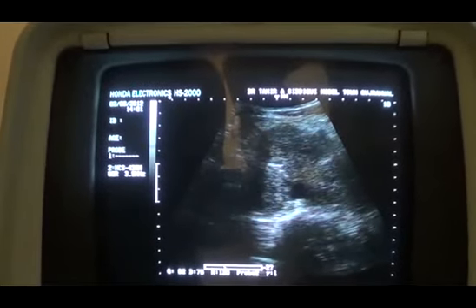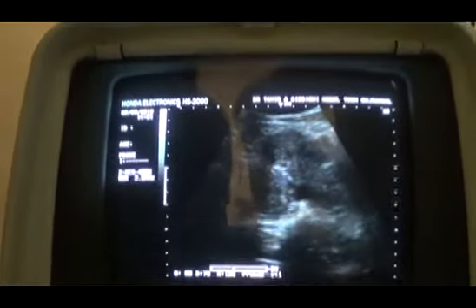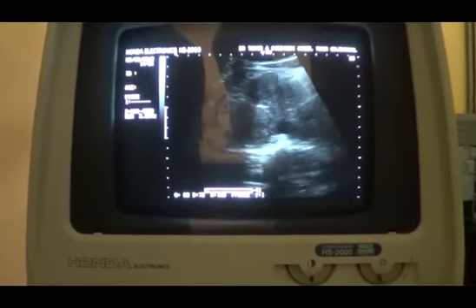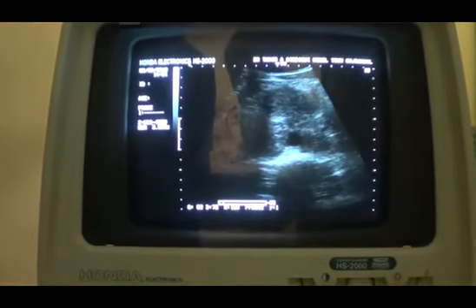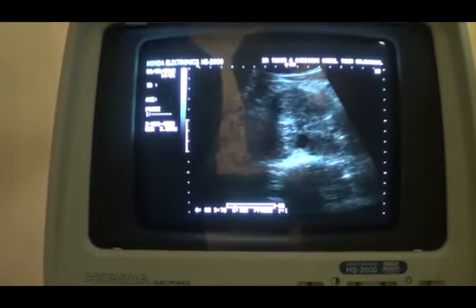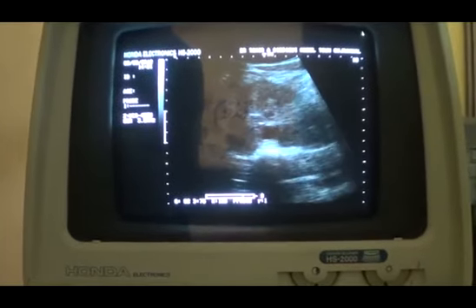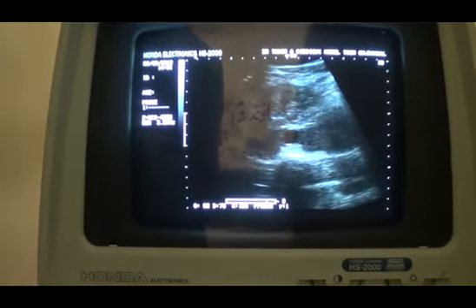In this case, as I am not provided with laboratory findings, any other investigative procedure, or detailed clinical examination and history, in such cases you just rely upon giving out the findings. Just narrate the findings in detail and leave the rest to the referring doctor, so that you may get a feedback later on.